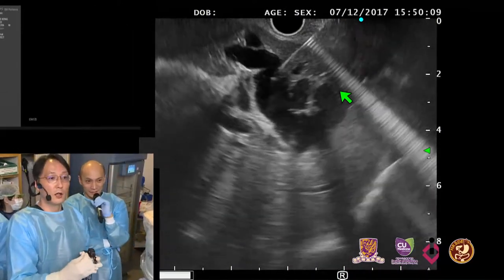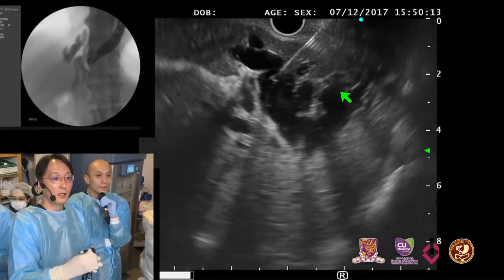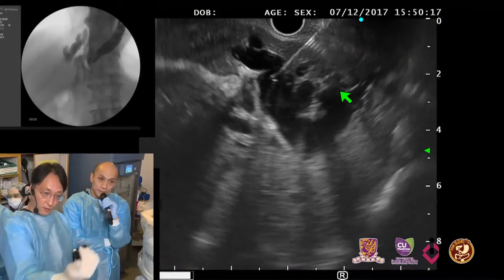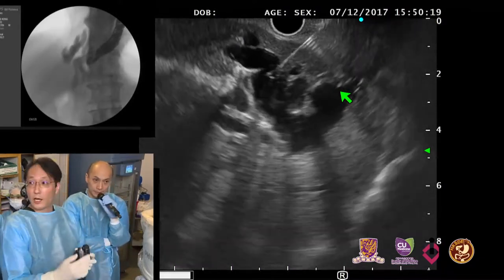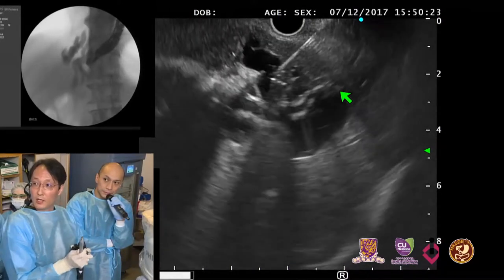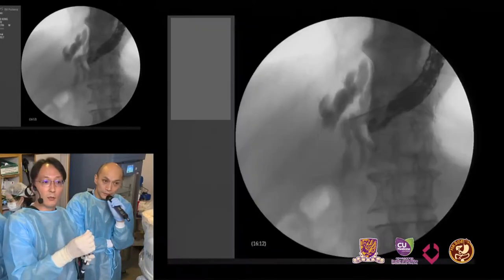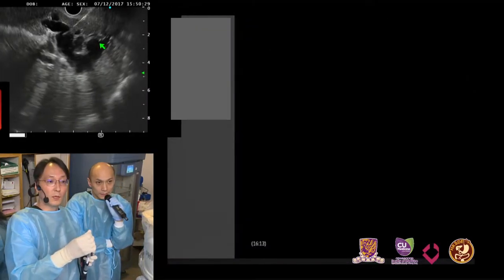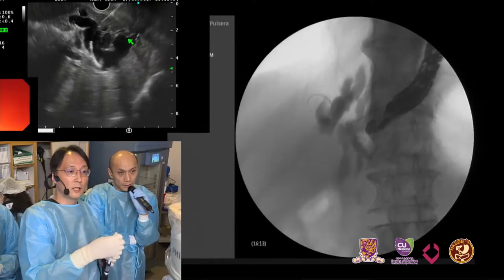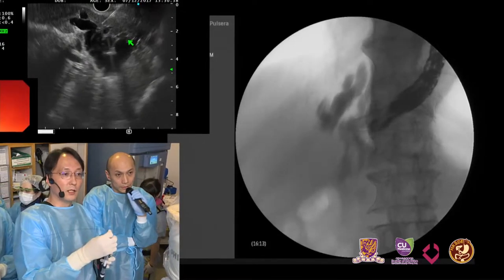Yeah. So I use the VisiGlide 0.025. Then here sometimes the guidewire goes so far. It's going peripheral. Yeah, right. At the time, using the wire-needle impaction technique, the guidewire and needle are withdrawn a little bit here, right? It's like this one. Then we manipulate again here. It's like this very one. Nice. Then the looping technique is important.